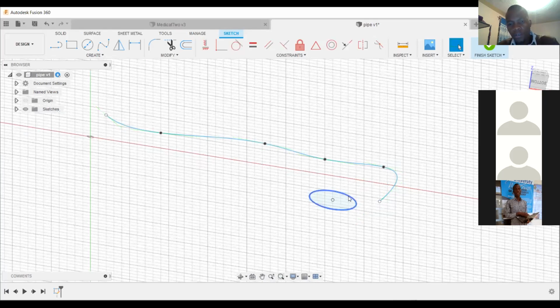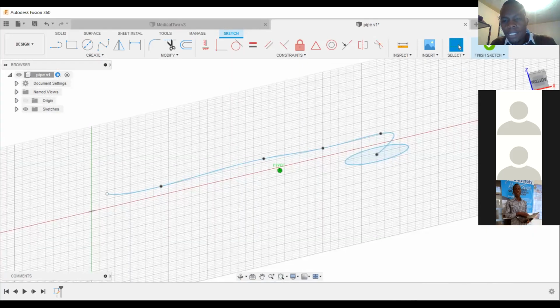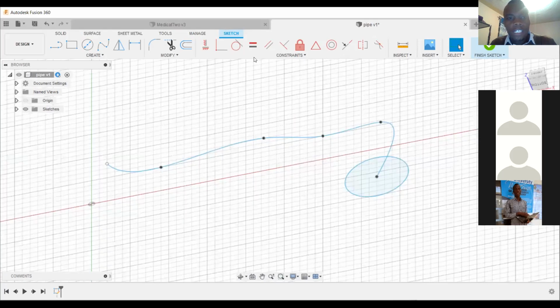Let me show you. We want to make them tangent. So you just draw a circle where the line ended. So it becomes like that. Then you create this to be perpendicular to this.